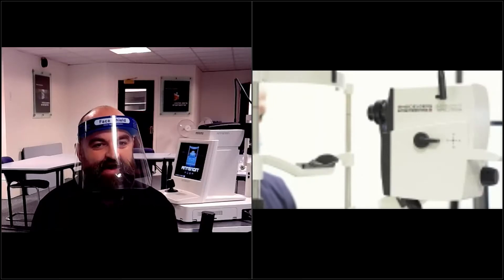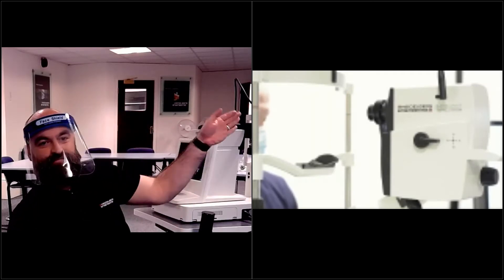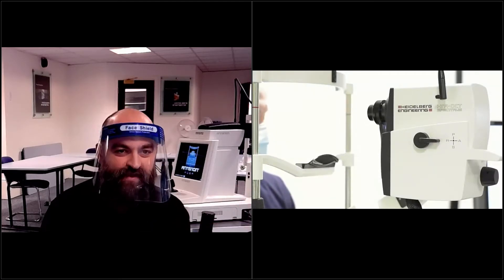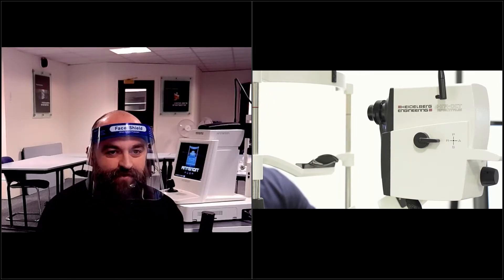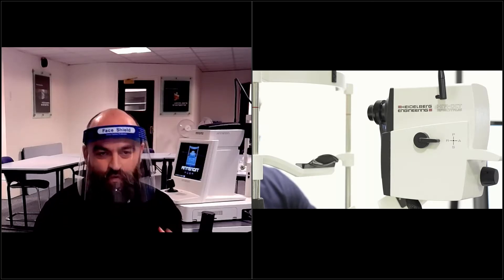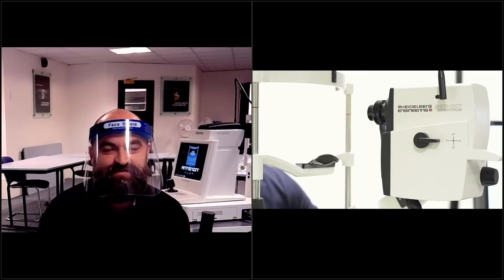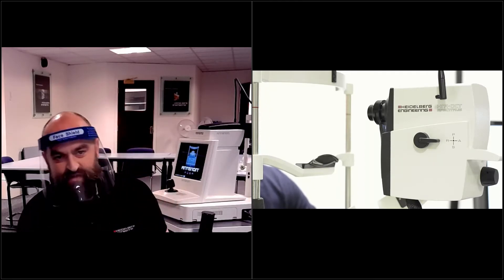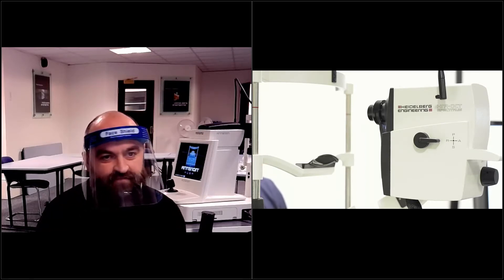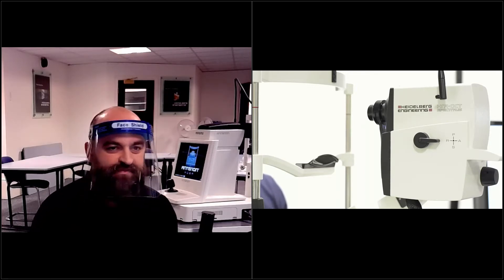Welcome to this evening's virtual live workshop. I'm joined tonight with my colleagues Emily, on the left, and Nathan, who has donated his eyes for us this evening. We're really focusing on anterior segment OCT. This is quite ambitious tonight — we're actually using two devices. On your screen you should be able to see the Spectralis camera, and you'll also see this machine next to me, the Anterion OCT machine, which has been out for around a year commercially.